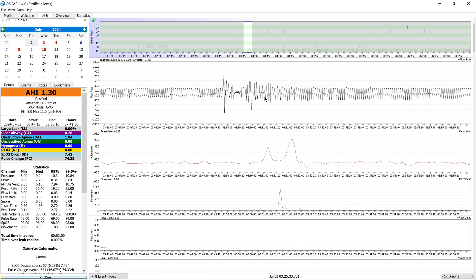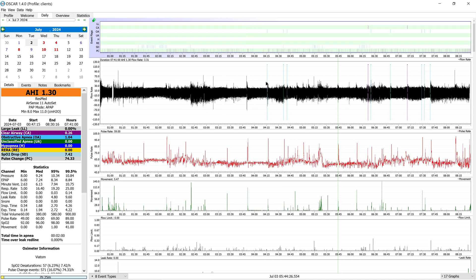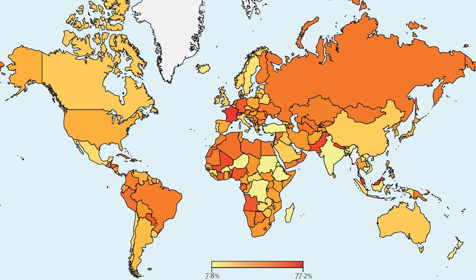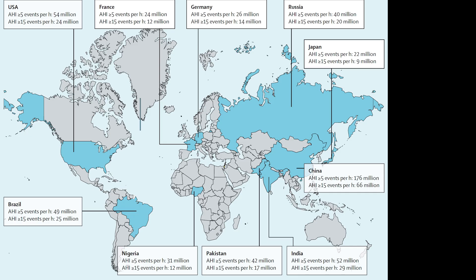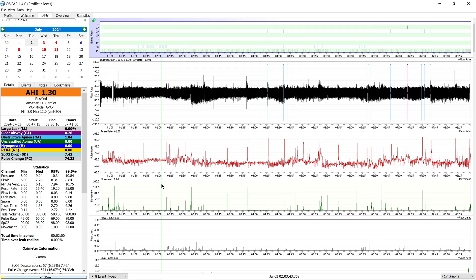For example, you can have pulse spikes from nightmares — everyone knows this. You don't have to have sleep-disordered breathing for your heart rate to get jacked up. So the takeaway: we can use pulse oximetry to get a better understanding of whether or not there is an event, and very likely a physiological arousal — but we can't say for sure. What I can tell you is it's not normal for your pulse rate to spike up 40 points 200 times during the night. Give your pulse oximeter to someone who you know has good sleep and no sleep-disordered breathing to compare — but be careful, because probably 25–30% of people have this to some extent.